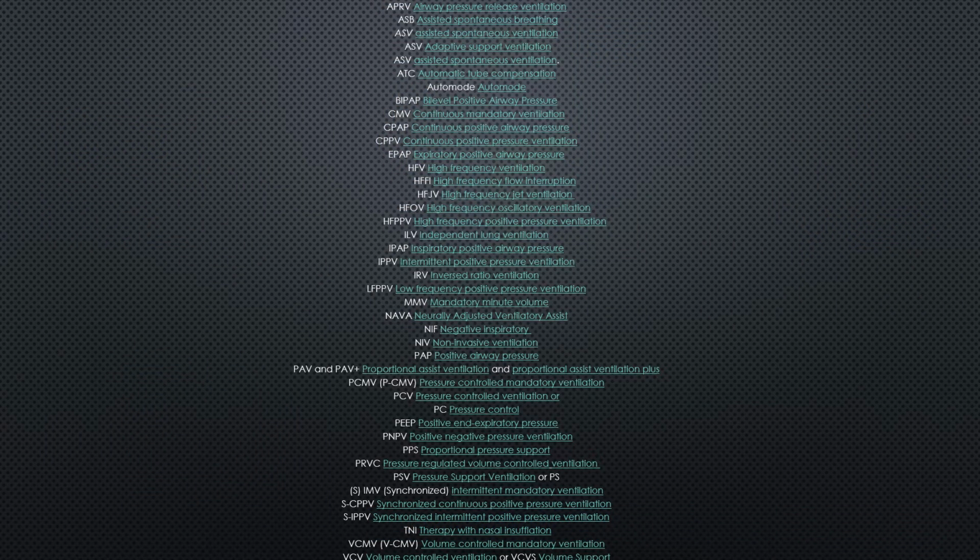There are a number of ventilator modes available out there, and it can be extremely confusing if you are new to intensive care. Principles may be similar among some of them, but they are named differently. This is because of the licensing, trademark, and copyright. Different ventilator manufacturers name the modes differently. Please try to familiarize yourself with the ones that are used in the intensive care unit where you are working.